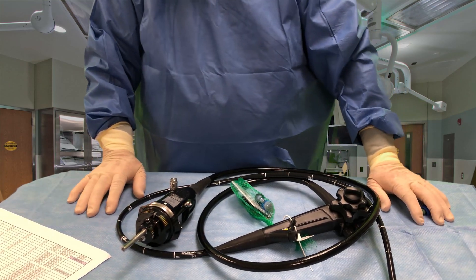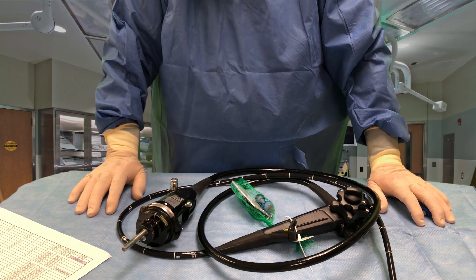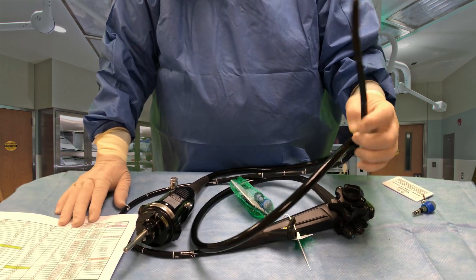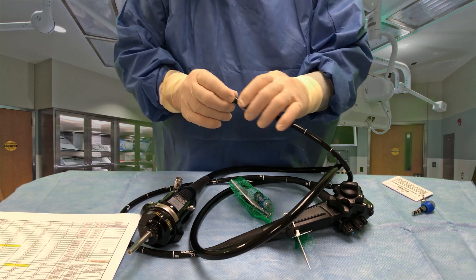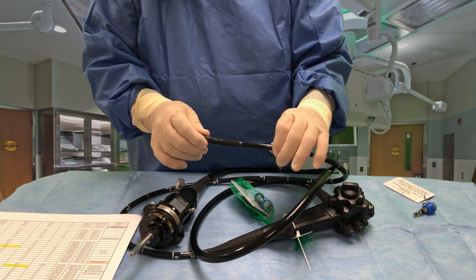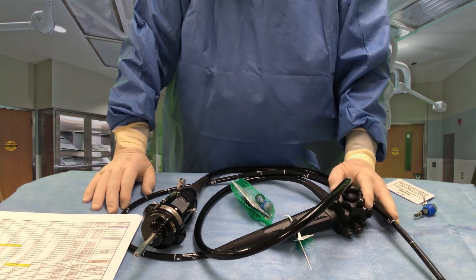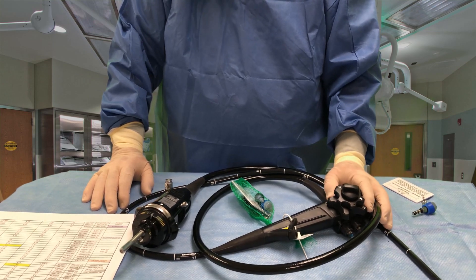So that about does it for the Olympus GIF-H190 scope. A couple of quick specs: 2.8 millimeter working channel, the distal tip diameter is 9.2 millimeters, the insertion tube is 9.2 millimeters, and the working length is 102 centimeters. This is a fantastic scope, particularly for doing diagnostic screening and for several therapeutic uses.